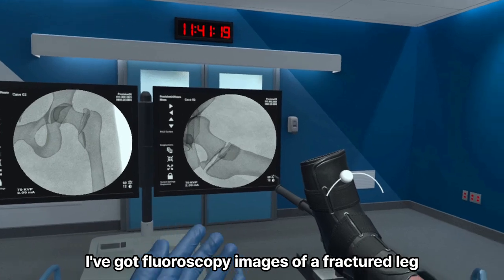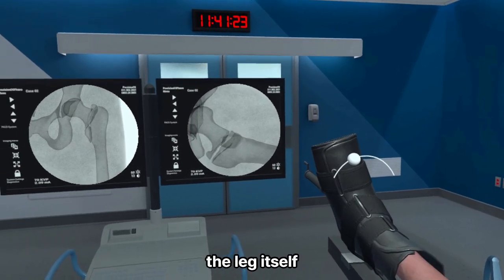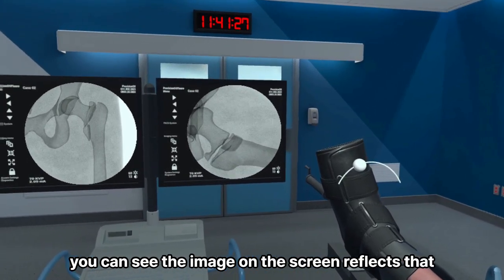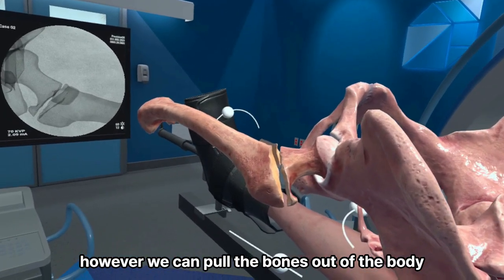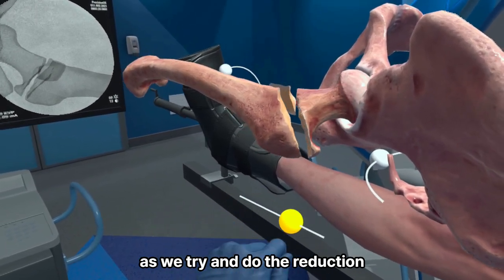As you can see, I've got fluoroscopy images of a fractured leg, and traction sliders here that allow me to adjust the leg itself. As I take images and adjust these sliders, you can see the image on the screen reflects that. Building a strong concept of 2D visualization into 3D structures can be difficult. However, we can pull the bones out of the body and visualize this directly in front of us as we try and do the reduction.